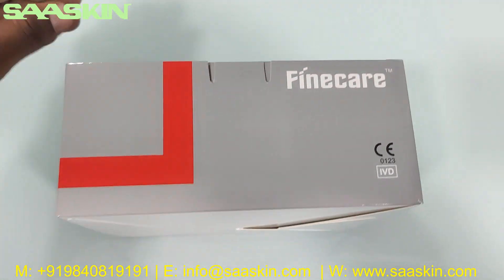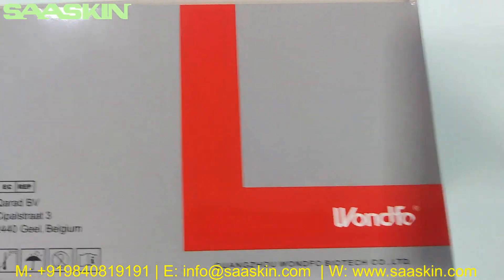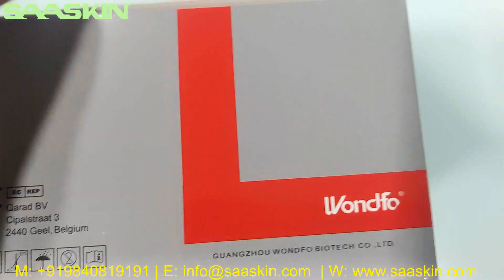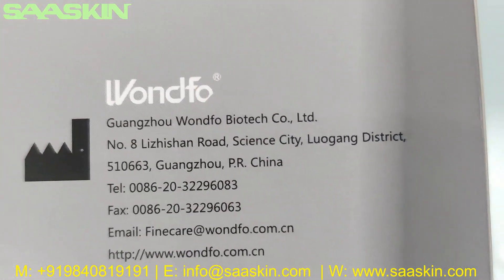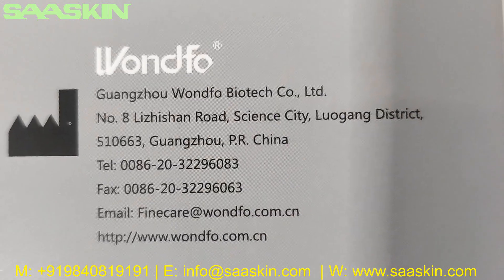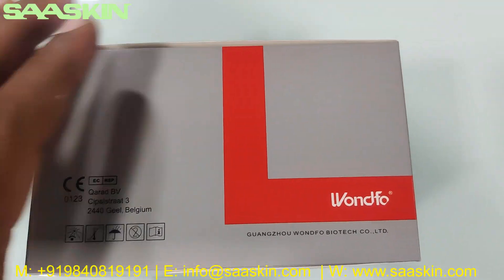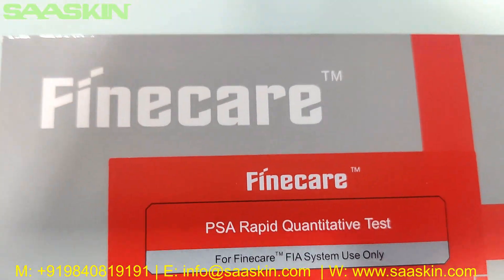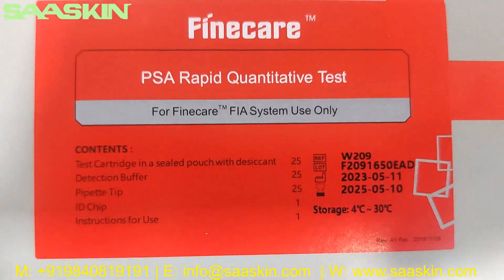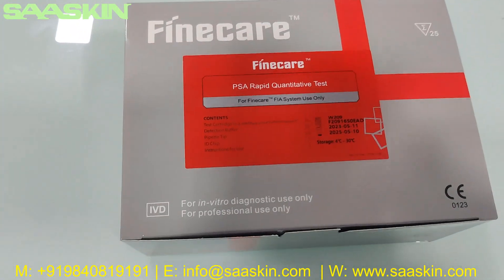I will just show you around the box. You can see it is CE certified. This is from Wondfo FineCare, from Wondfo China. This is the FineCare PSA Rapid quantitative test — the FIA test cartridges kit which is used in the FIA machine only.